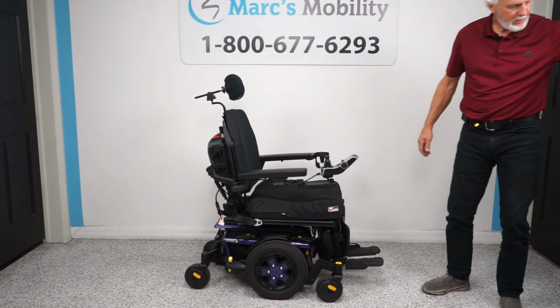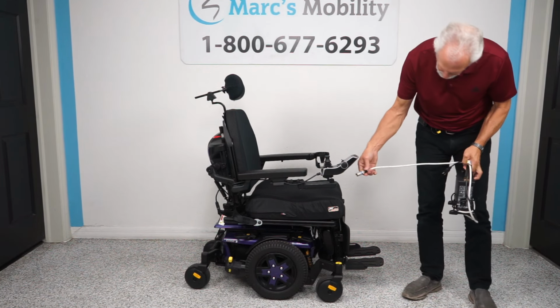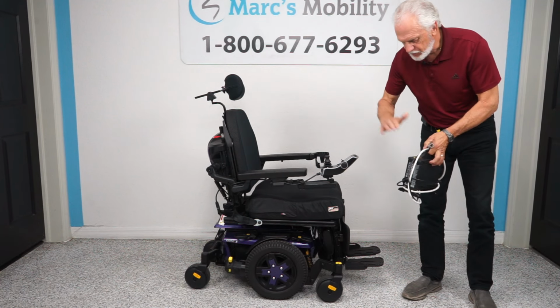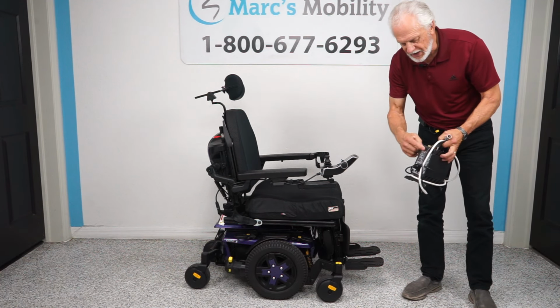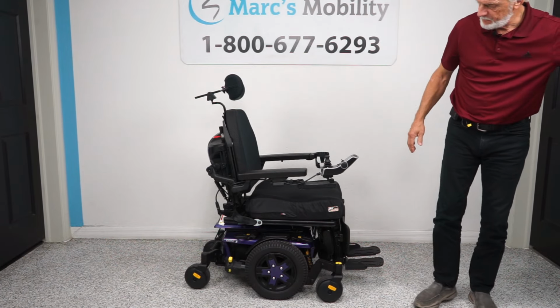And when you charge the batteries in this chair, you take your charger and you plug it right here, right below the joystick, right there. And as soon as the batteries are full, the charger will stop charging. Or when the light goes from orange to green, the charger will stop charging.